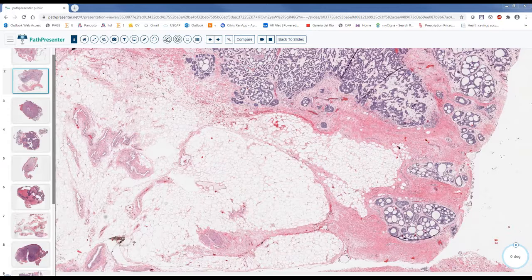You can do CD117, and usually it will be positive in adenoid cystic carcinoma and negative in basaloid squamous cell carcinoma, or sometimes both. If everything is negative, sometimes it's not an easy answer.